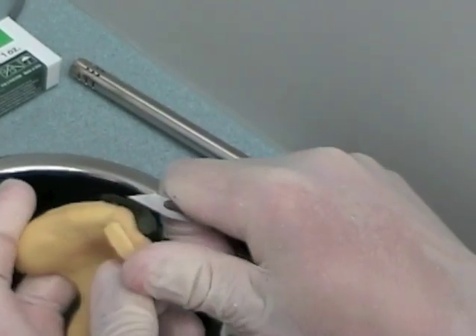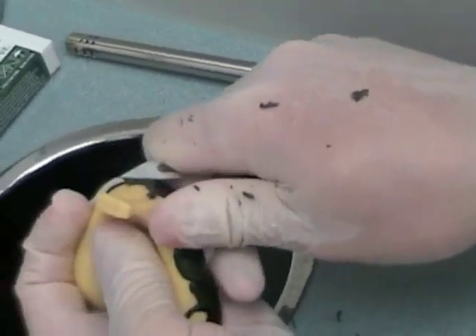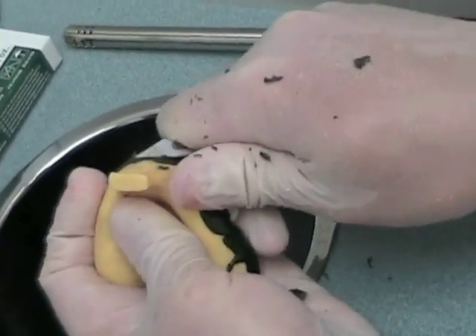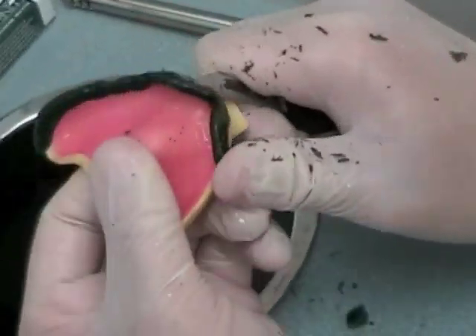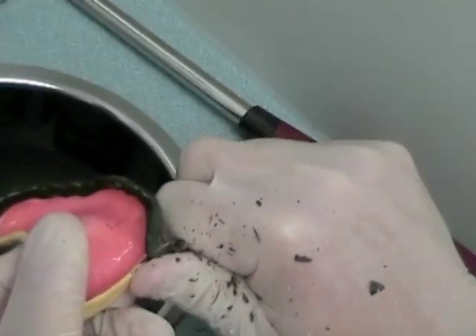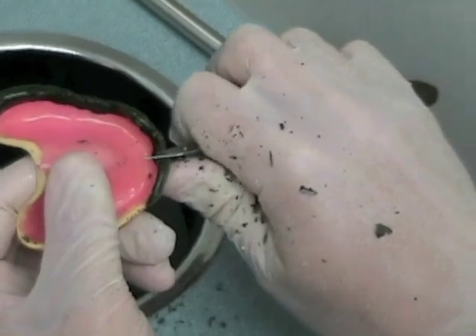If you've molded the compound properly, you will probably find that some of it will fold over onto the buccal surface and make the flange much thicker than you want. You can use a red-handle knife with a scalpel blade to thin and blend the compound with the rest of the tray. Make sure to use a good finger rest so you don't cut yourself. The object is to get the periphery 3 to 5 millimeters in width, making sure to blend it with the tray so that the junction is seamless.